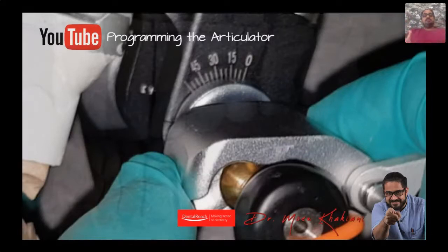This will help you understand how I use the protrusive bite to set the H value on a semi-adjustable articulator. The articulator that I prefer to use in my practice and during my courses comes from a company named Corrident. It is nothing but a copy of a famous Dentatus articulator, just that Corrident gives it to us cheaper. All right.